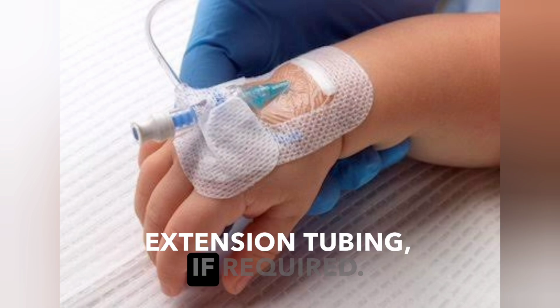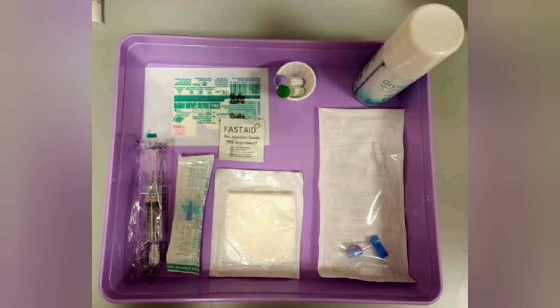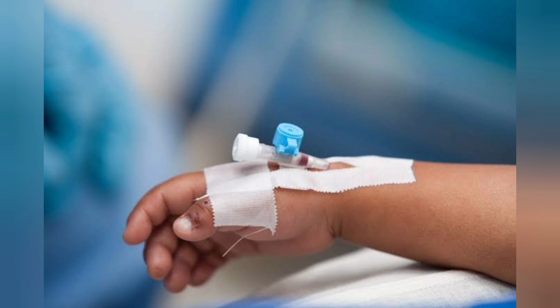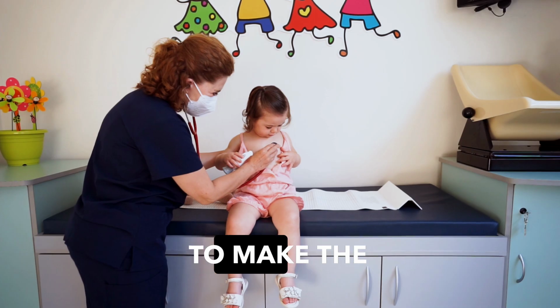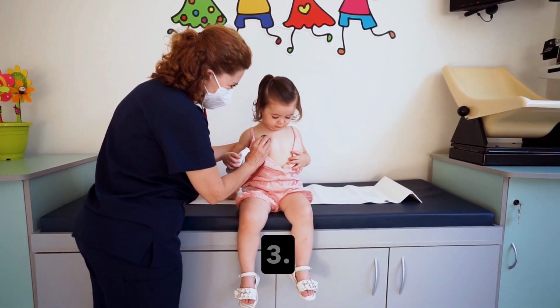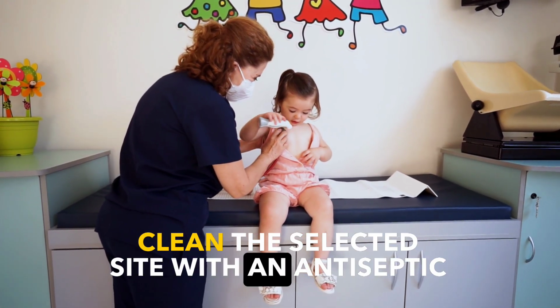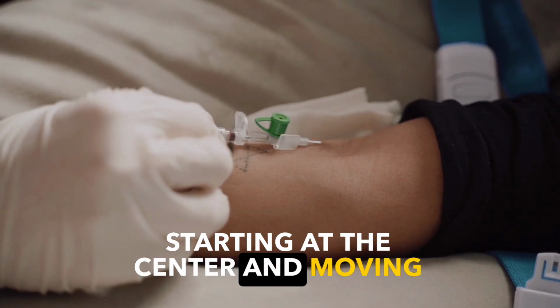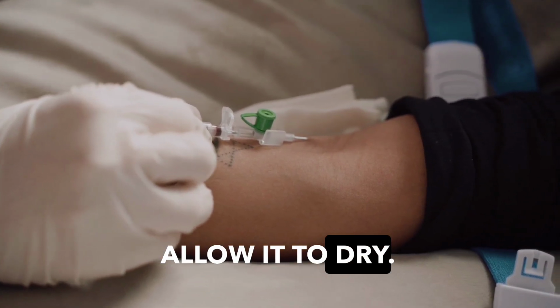Extension tubing, if required. Procedure steps: 1. Wash hands and wear sterile gloves. 2. Apply a tourniquet above the site to make the vein more prominent. Avoid excessive tightness. 3. Clean the selected site with an antiseptic solution in a circular motion, starting at the center and moving outward. Allow it to dry.